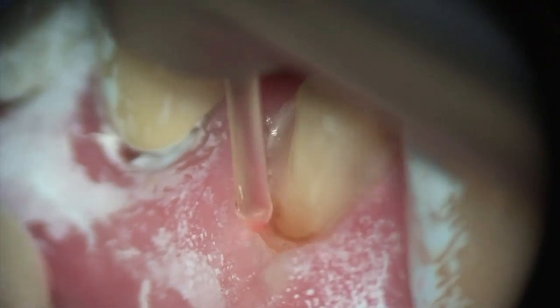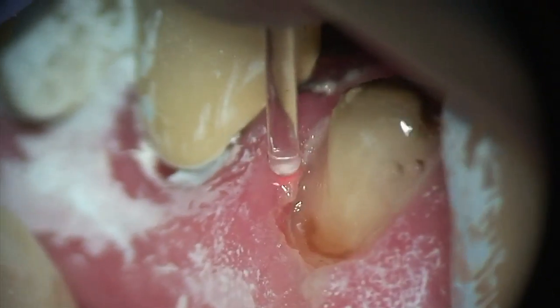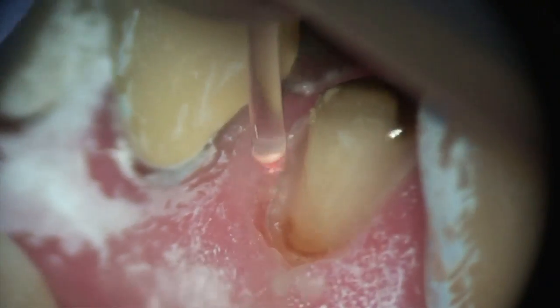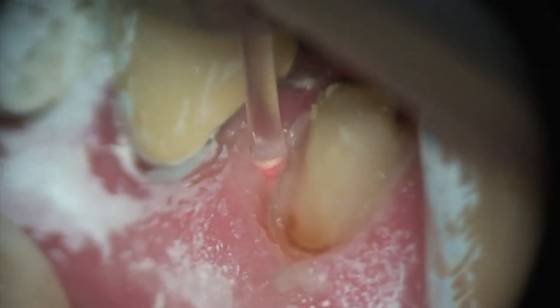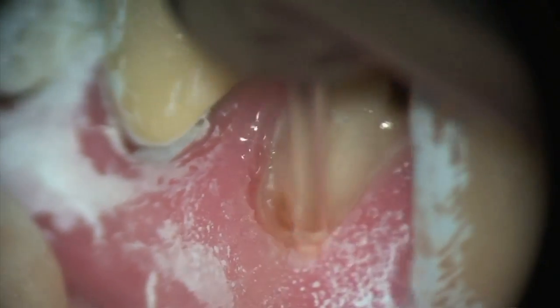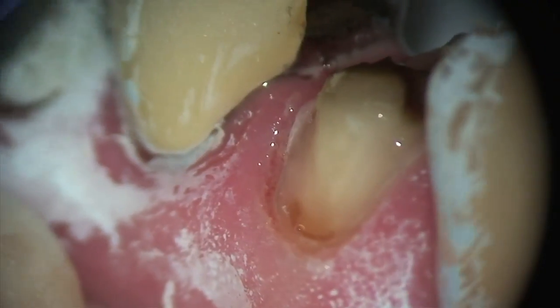In this case, I'm performing this crown preparation for a CEREC. You can see CEREC powder and spray on the adjacent tissue and teeth. So I'm going to create a shoulder here, and what I'm going to do is remove the tissue and trough around my margin to expose my margin, so I get a nice read by my computer.